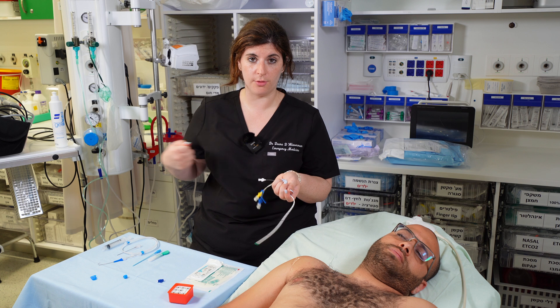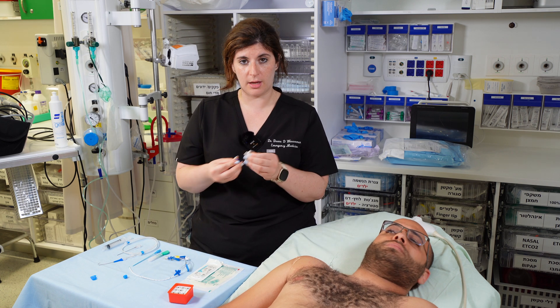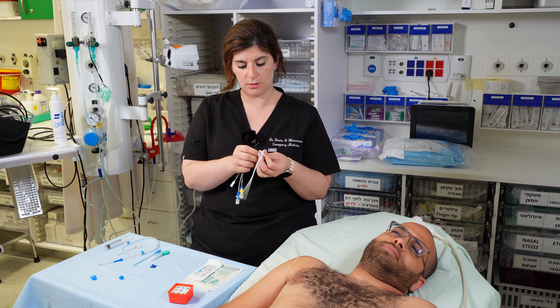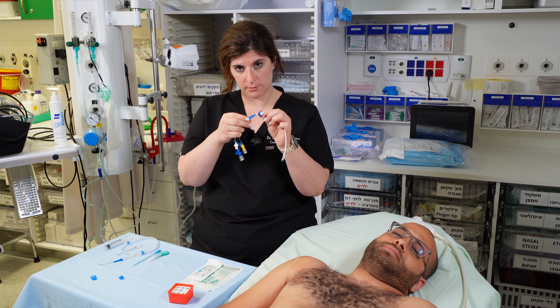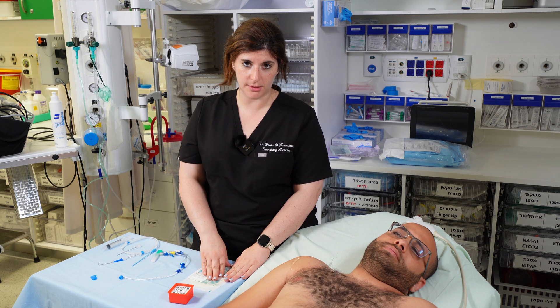Once your line is in, pull the wire out. The holder piece keeps the line in place if you haven't threaded it all the way in — place the white piece on the line itself and lock it in place with the blue piece. Once that's done, sew the line in and place a dressing.